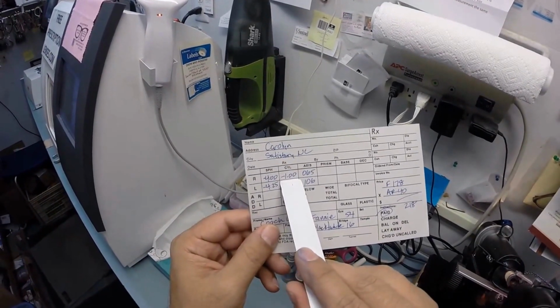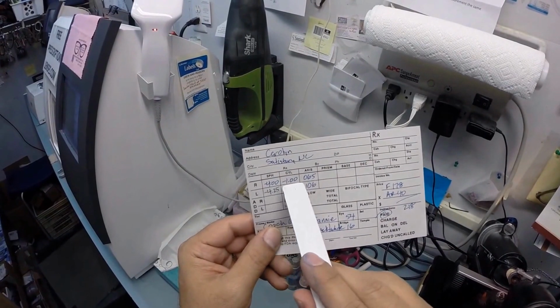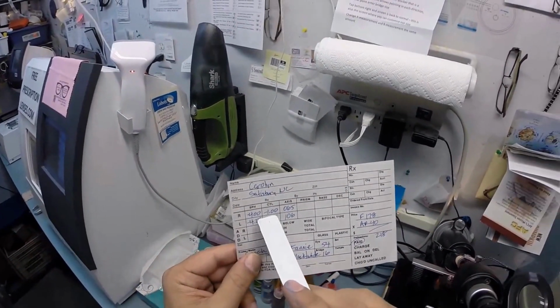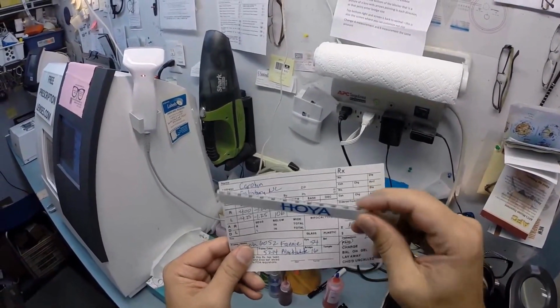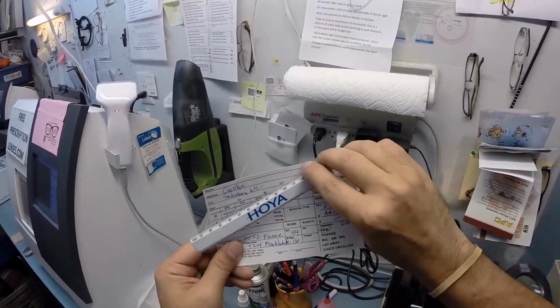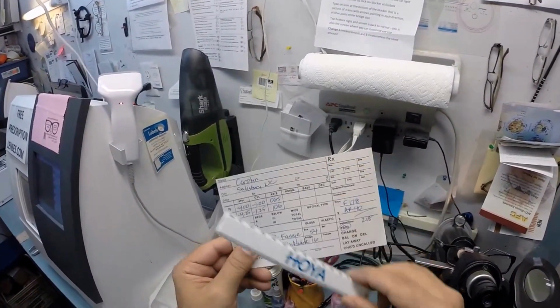Think of astigmatism as the fine-tune knob. This first number makes everything the correct size. This takes away the fuzzy edges, so 6s and 8s or the letters P and F don't look alike. Now we're going to turn that fine-tune knob to 65. A straight line is from 0 with 90 in the center and 180 on this side. We're going to turn that knob to 65, just past the 45-degree meridian, and stop about there.